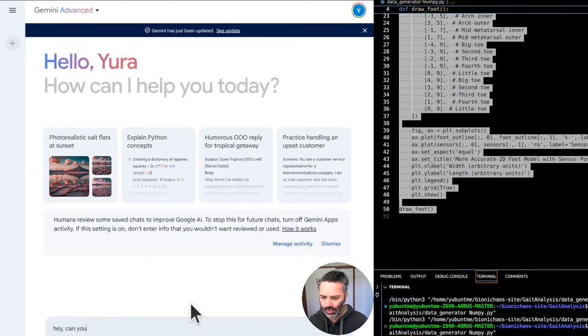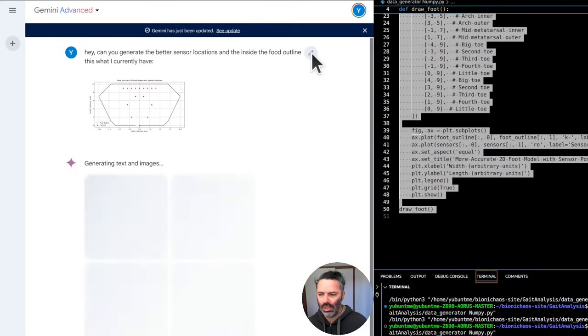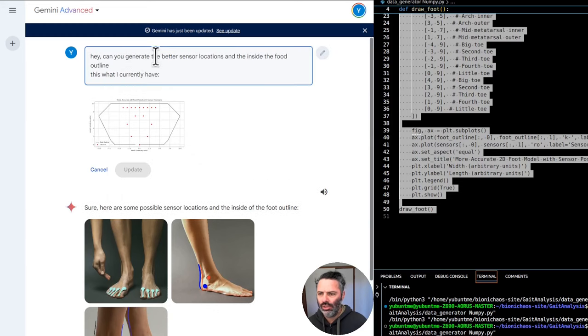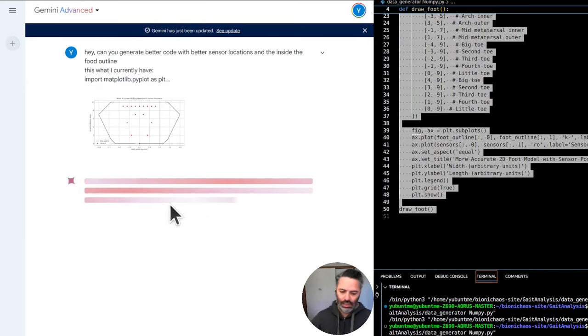Hey, can you generate a better outline for the sensor location and the inside of the foot outline? This is what I currently have. Oops, got the code. Can it just generate the code? That's generating images. Why? Okay, can it generate better code with better sensor locations? I need to send it into Python mode. Python mode.